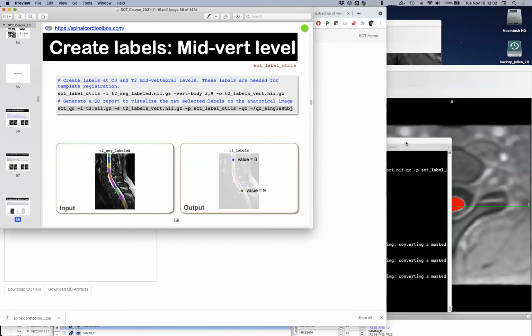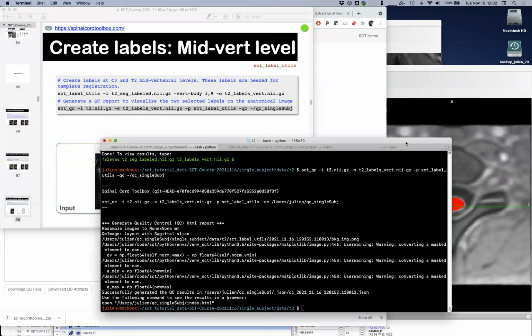Right, so you're talking about the multiple cores used for the registration to the template, for example, with ITK routines. There we can use a particular flag to force it to use only one core if you want to process multiple subjects in parallel.